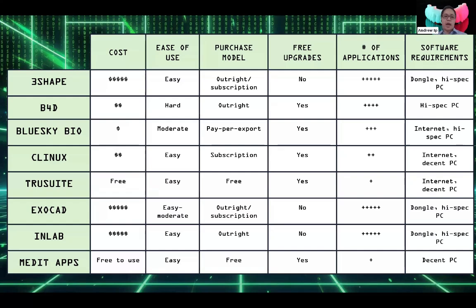There are programs like exocad and 3Shape, which are very expensive, but they're very comprehensive. So if you really want to go all out, then that's the way that you should go. Otherwise, you have simple programs like Medit Clinics, the True Suite, simpler programs that are a lot more affordable, but probably a lot easier and less confusing for the clinical user. It's something for you to think about before you make the plunge and invest in expensive software where you may not use 50% or 60% of all the functions.